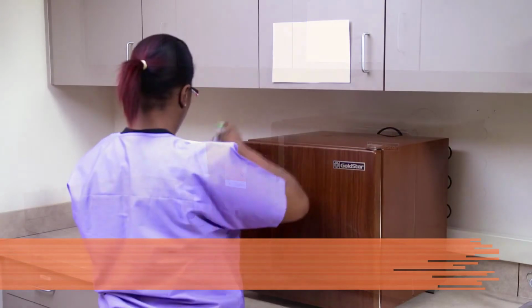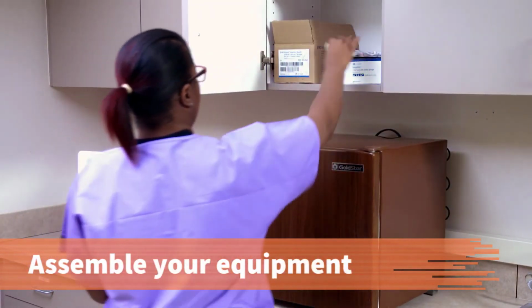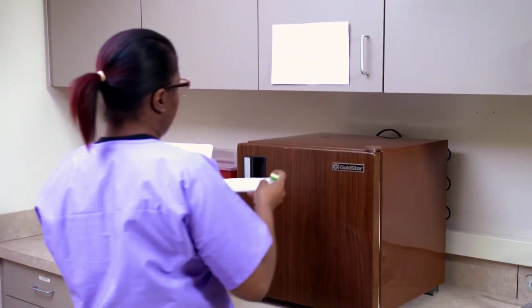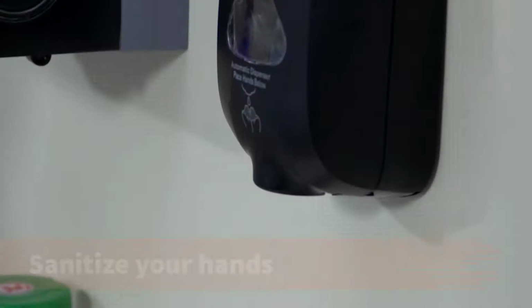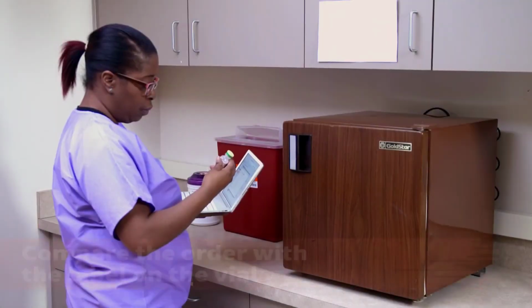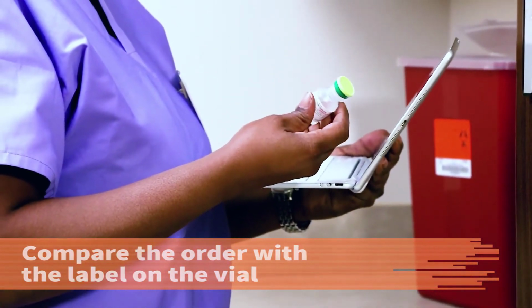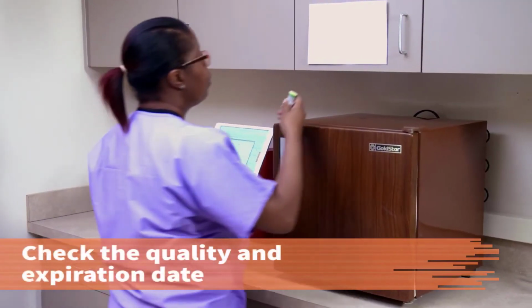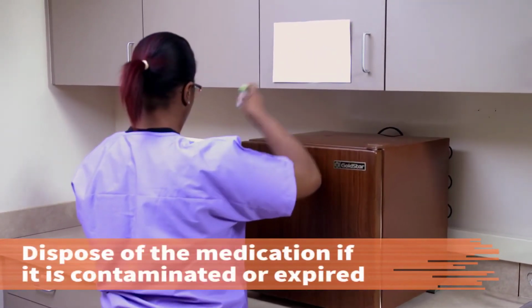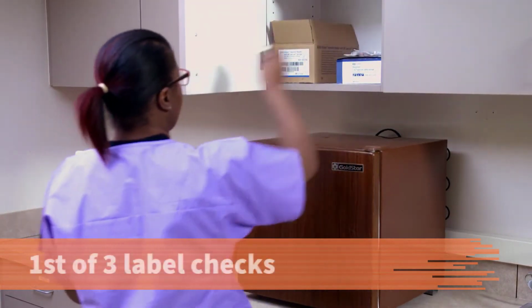Assemble the required equipment. Choose the correct syringe and needle unit, depending on the site of administration, patient characteristics, and the amount of medication to be injected. Before you dispense the medication, sanitize your hands. Compare the order with the label on the vial of medication when you remove it from storage. Check the quality of the medication and the expiration date on the container, and dispose of the medication if it appears contaminated, contains sediment, or has expired.